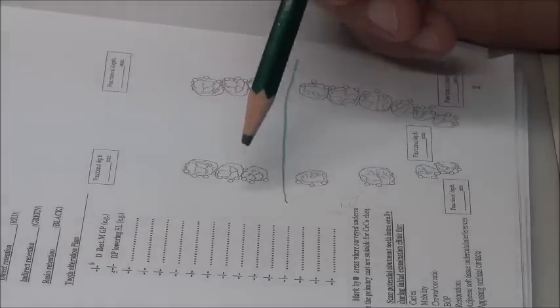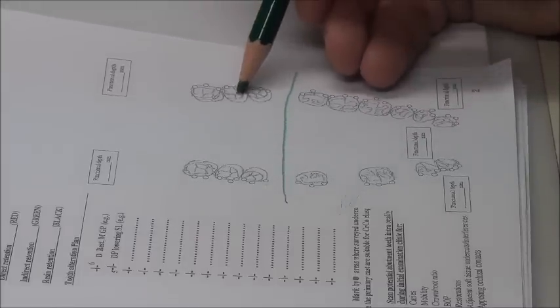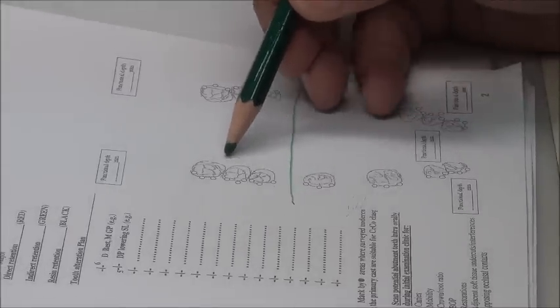What about indirect retention? Okay, I need indirect retention. Where do I get indirect retention from? I begin sending rests more back. I begin sending rests on posterior teeth. I could place them on the 7, distal of the 7, or mesial of the 8, and I could extend my design up to there. Okay?